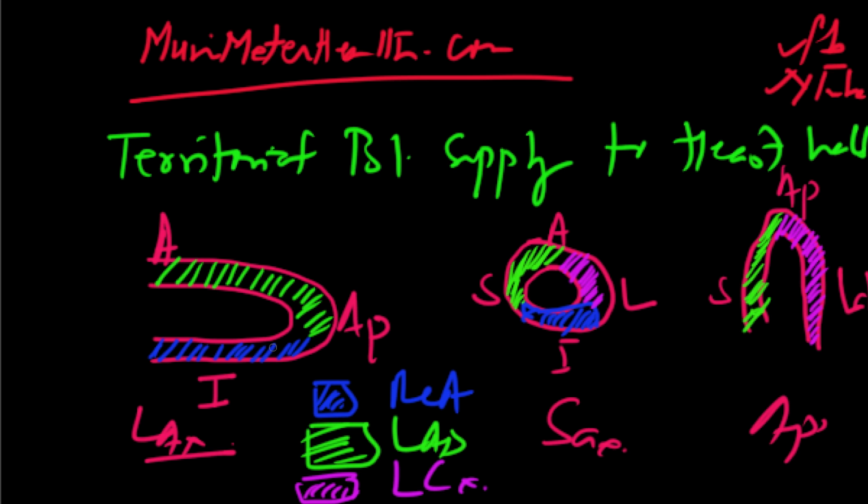RCA is the inferior wall, which is seen in the long axis view in this fashion. And then, of course, in short axis, it's a sufficient supply, if you will. So right from base to apex, and you can take several sections of these short axes and go almost to the apex where the cavity obviously will diminish. And you can take different cuts.